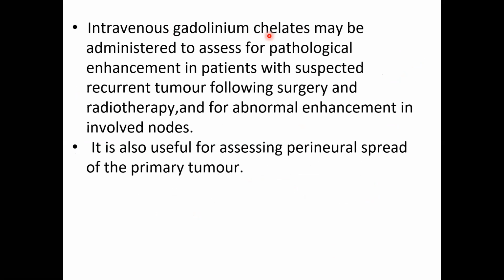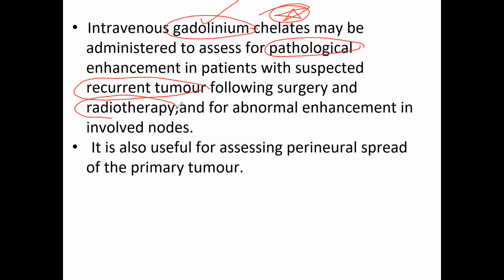Intravenous gadolinium chelates may be administered to assess for pathological enhancement in patients with suspected recurrent tumor following surgery and radiotherapy, and for abnormal enhancement in involved nodes. It is also useful for assessing the perineural spread of the primary tumor. Very important. Gadolinium contrast is especially useful for tumors like acoustic neuroma.